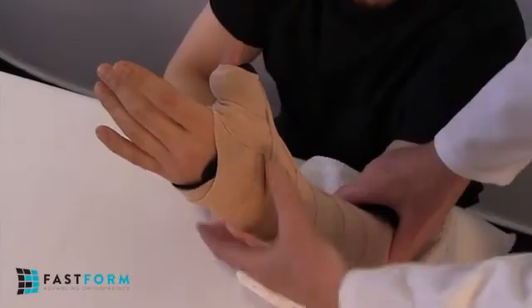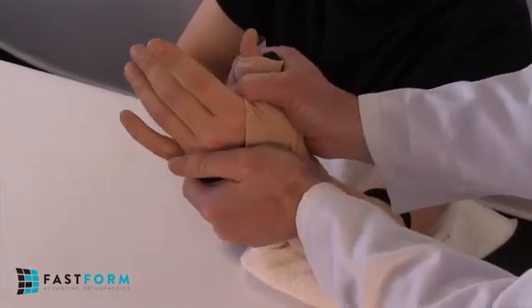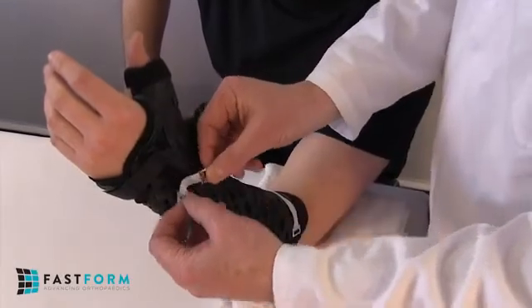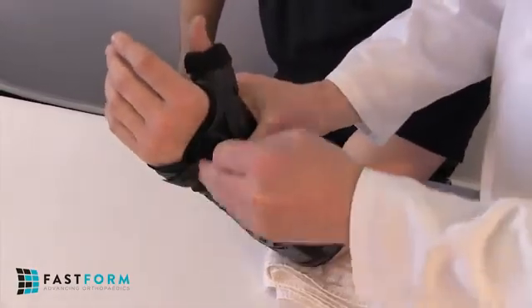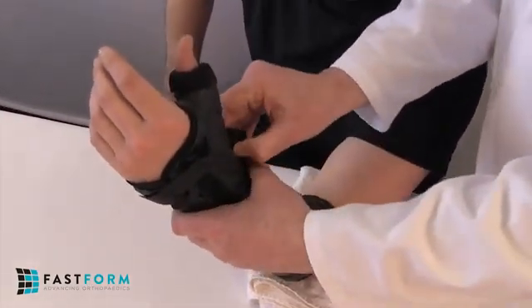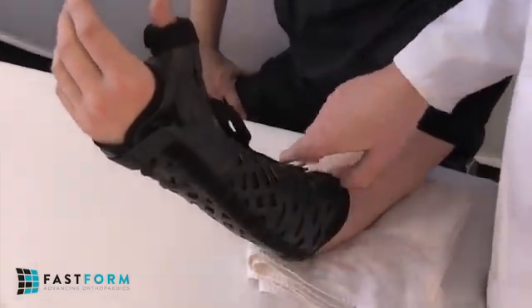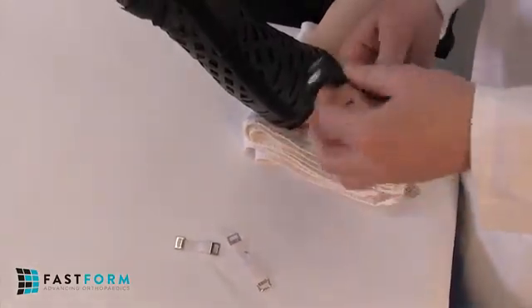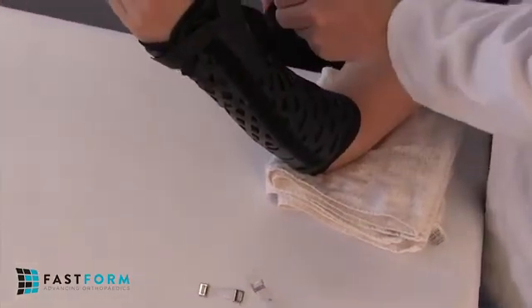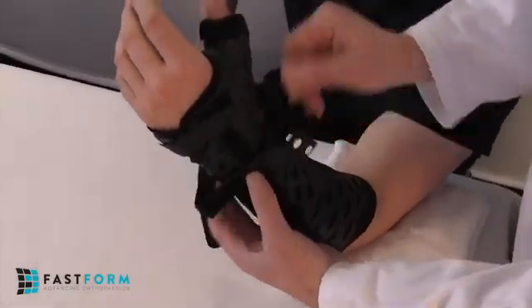Then, work proximally by cupping the wrist and overlapping wing sections into position. When fully rigid, remove the bandage wrap and clips. Next, release the overlapping sections of the palmar cuff and radial hinge, as well as the overlapping wings. A combination of the thumb spica's overlap design and tensioning straps maintain patient comfort, while enabling swelling relief or prescribed compression. The primary tension strap has an optional compliance lock, which indicates and deters unauthorized removal.